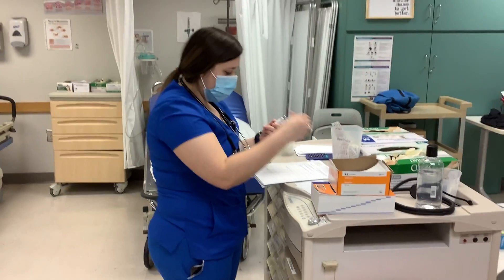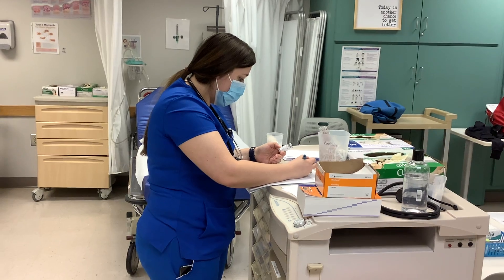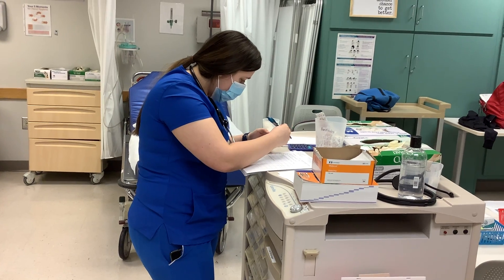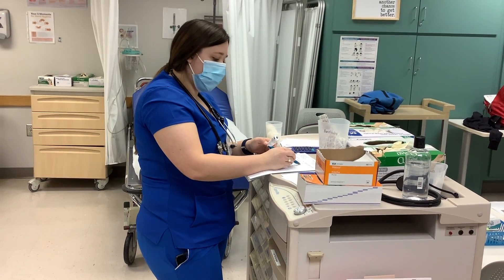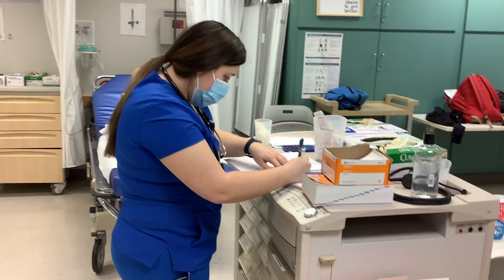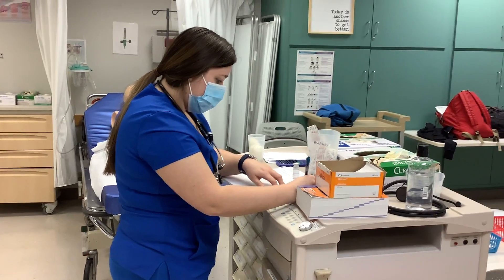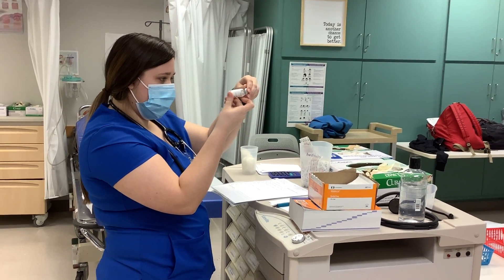Next, I'm going to do my Humulin N. We have patient Emily Johnson, patient ID 361-80-6612, date of birth 12-16-XXXX. Allergies include morphine and codeine. We have the Humulin N injection, U-100. Expiration date is 12-20-2050, it's unexpired. It is 0730 and this medication has not been given. Med-math: x units — 15 units is one dose, which is equal to 15 units in one dose. This medication looks good in the vial.